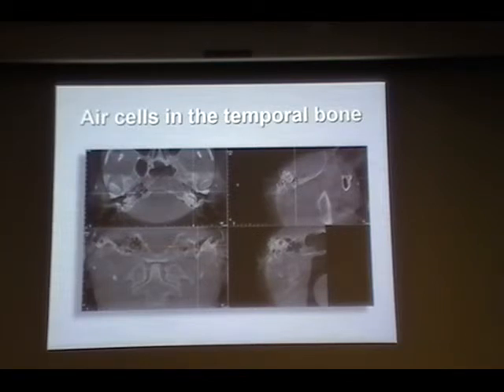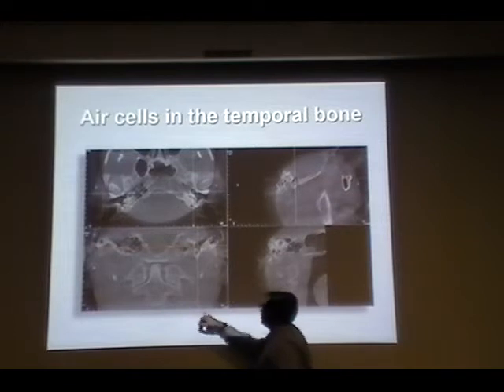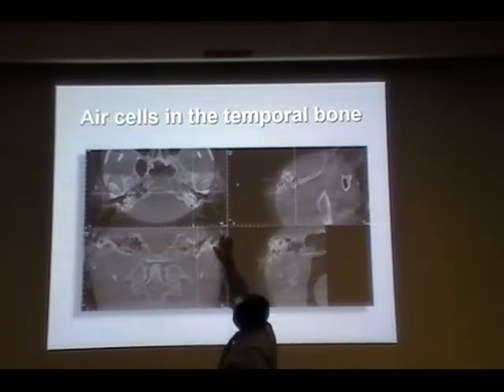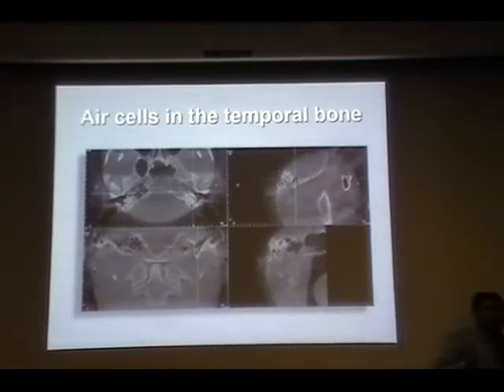It will tell exactly where I am checking or where I am pointing to. For example, here the patient's right side and patient's left side. Here the external auditory meatus and the canal. This is where it is correlating on all three planes. So, MPR view. This area, this area, this area means the same. That's exactly what I'm trying to look at.